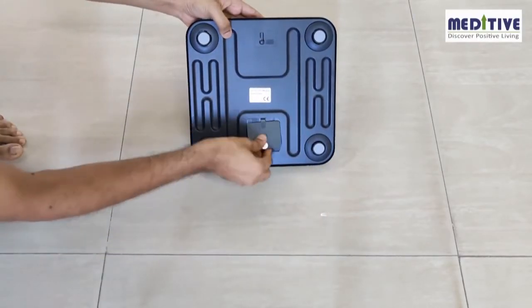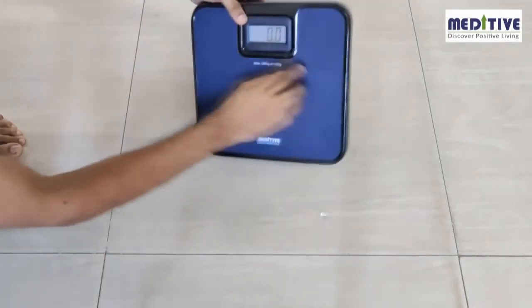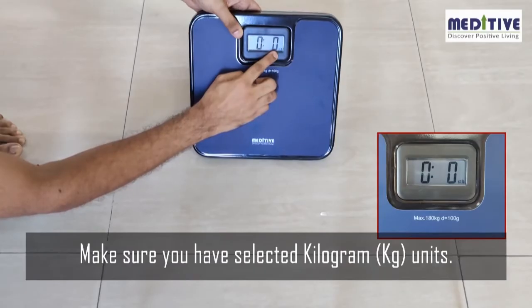Remove the plastic cap and insert the batteries to switch on the scale. This scale has multiple units of measurement — make sure you have selected kilogram (kg) units. The units can be changed by pressing the button behind the scale.